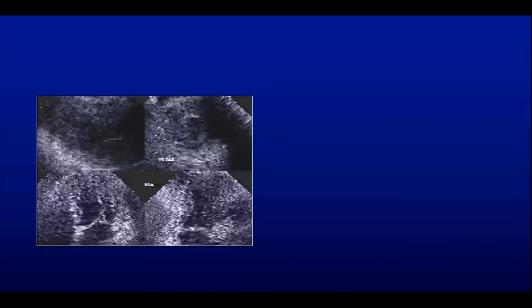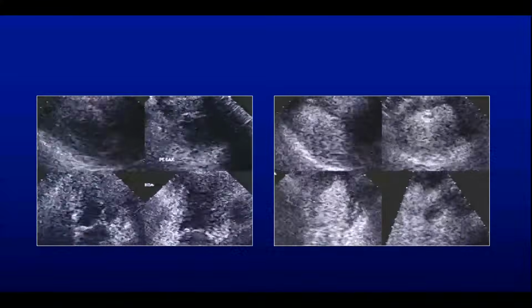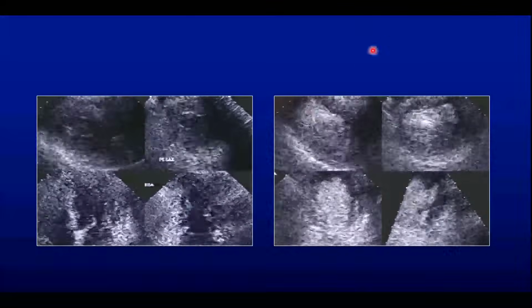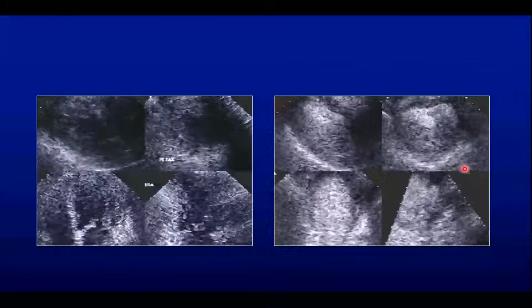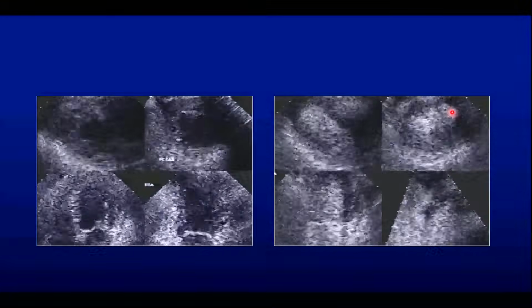Because, yes, your eye will extrapolate, right? I don't see every little endocardial border. And indeed, it is very abnormal, right? The abnormality is a very unusual situation. It is localized in the mid-lateral wall, mid-anterolateral wall.